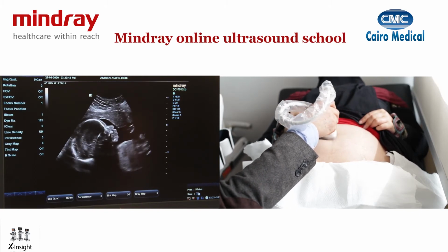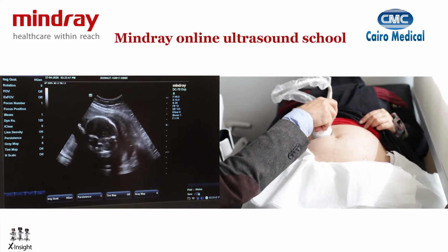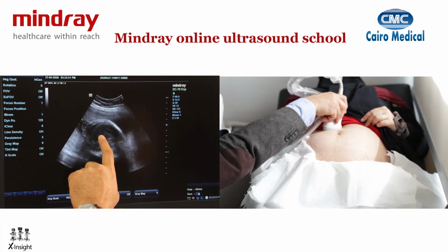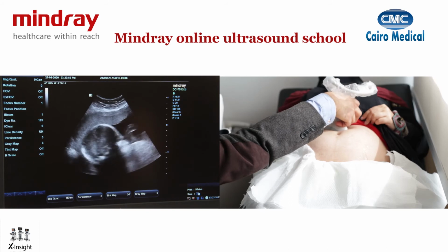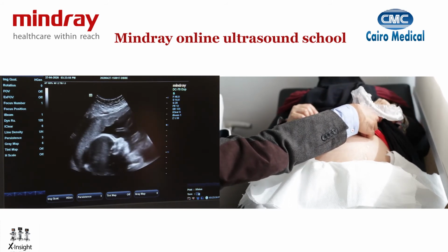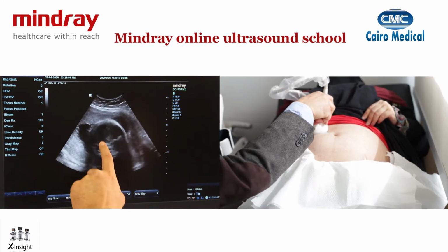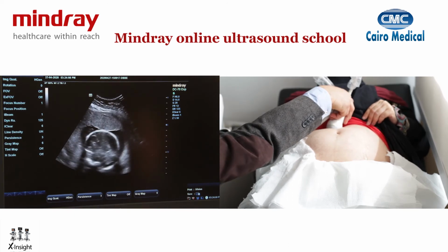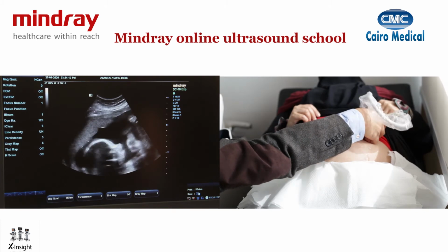In order to do that, the best thing to do is put the probe longitudinal, find where the midline echo of the brain is, which is this structure here. I'm going to move my hand until I get the midline facing straight upwards, and then I'm going to sweep my probe at 90 degrees, and that's when I can get a profile. So put the probe longitudinal, find where the midline is, move your hand until you get the midline to face straight up, and then if I sweep 90 degrees angle, I'm going to get a fetal profile.